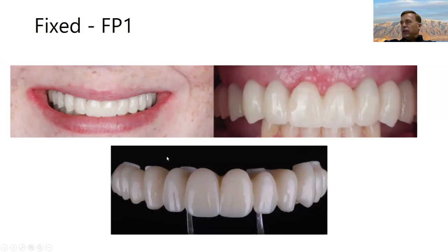If there's more bone loss on the right side here than the left side, the gingival aspect of the restoration is going to look canted, and you can hear the patient saying, "Oh, I think my teeth look sideways." It's like, well, you look at the incisal edge, and it's nice and straight. "No, up at the gum line. Can you fix that?" Kind of. So a lot of times these cases wind up being almost a full arch crown lengthening case.